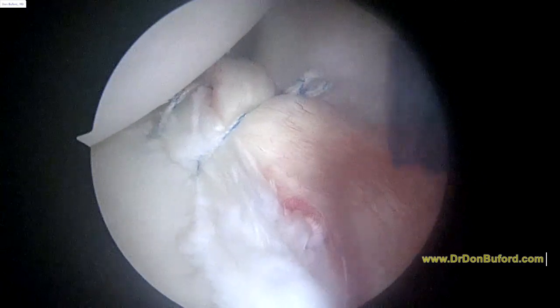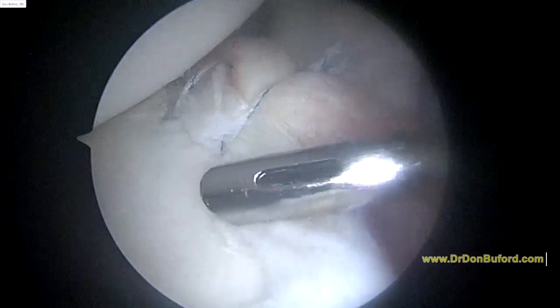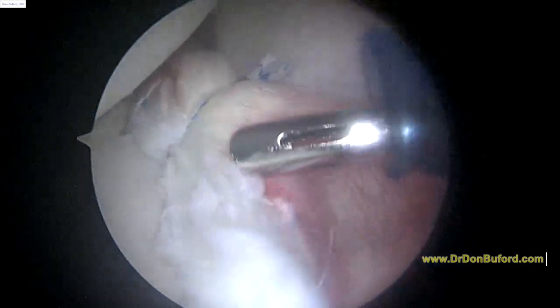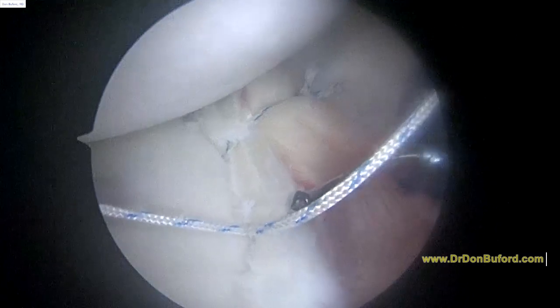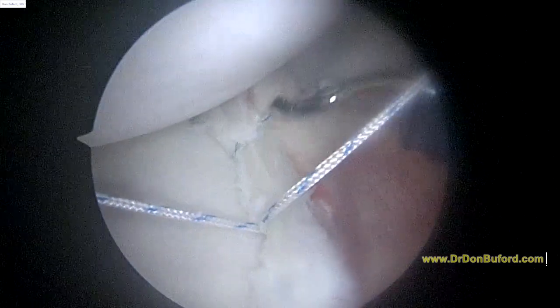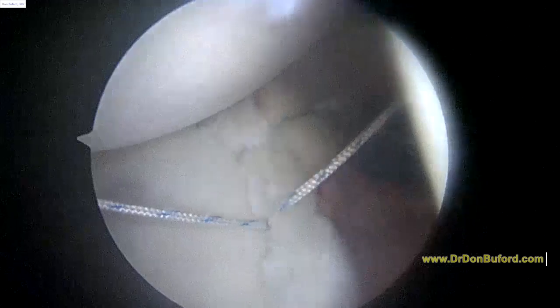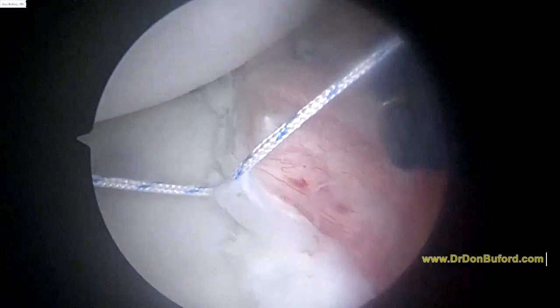I want to check and see. Sometimes we can make a pass through the actual cannula, but sometimes you can't get the angle. I just don't like that angle as much. We're going to make our third pass. This will be another simple interrupted stitch, I think. Look at it again here. You can already see, I think, how much this is tightening up this posterior shoulder.